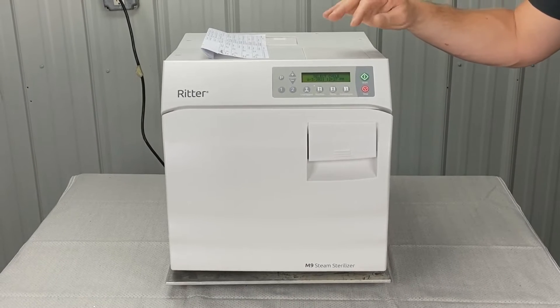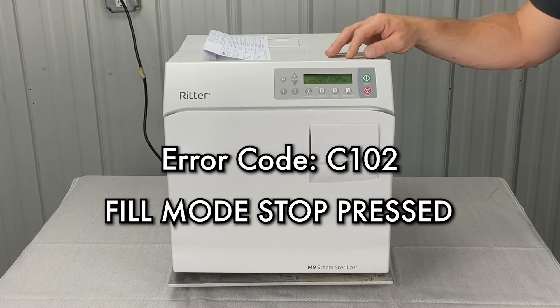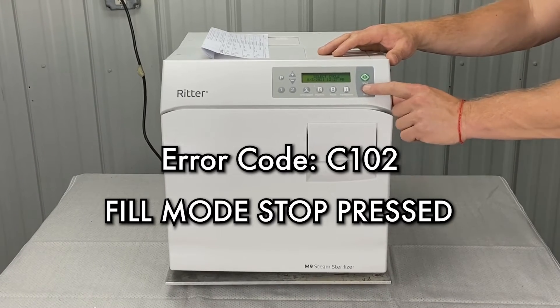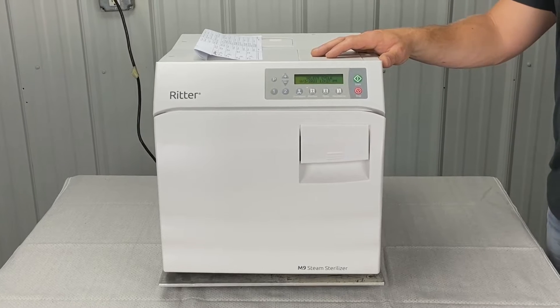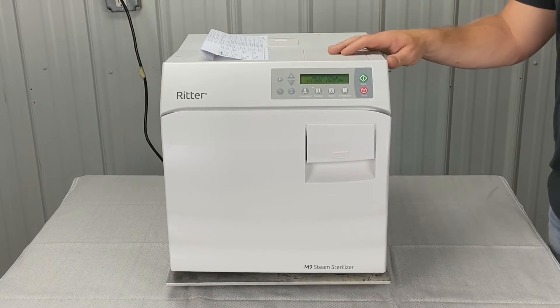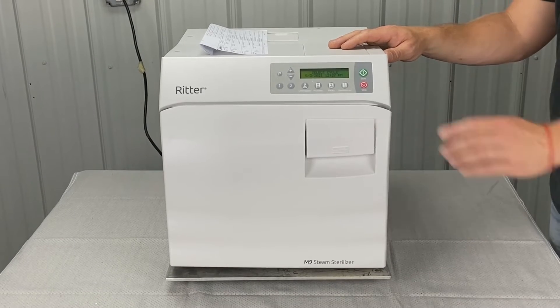Right now we're going to go over error code Charlie 102. That is: during fill mode, the stop button was pressed. The cause was the stop button was pressed — no check necessary. Press the stop button and initiate a new cycle.